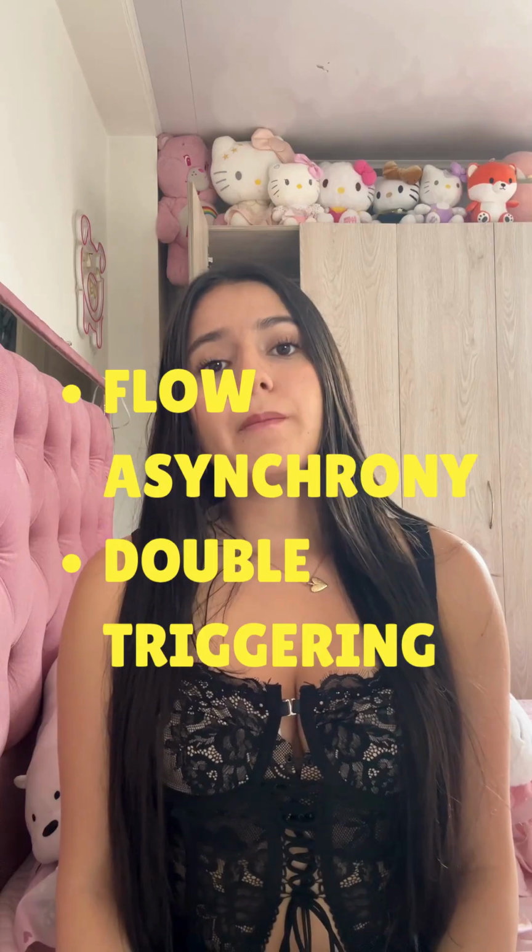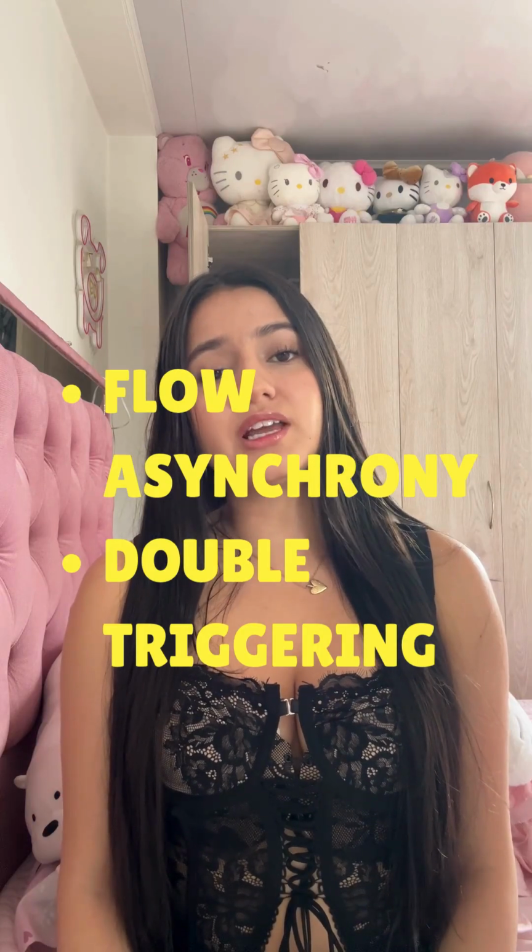Number 2. Ineffective trigger. Ineffective trigger is a condition where the patient makes an inspiration effort but doesn't activate the ventilator. It is commonly caused by out-of-range or low-sensitivity settings. It is classified as a triggering asynchrony.